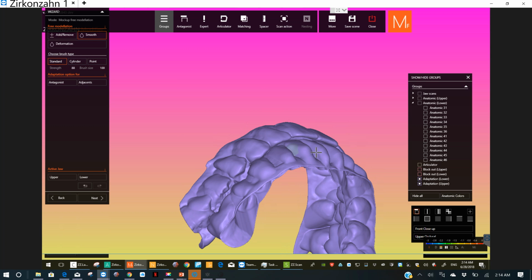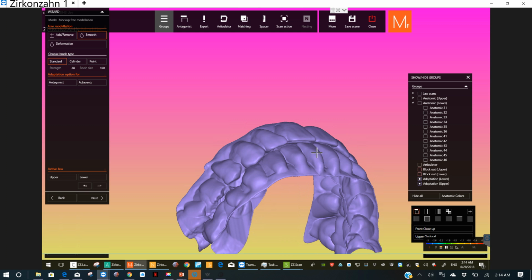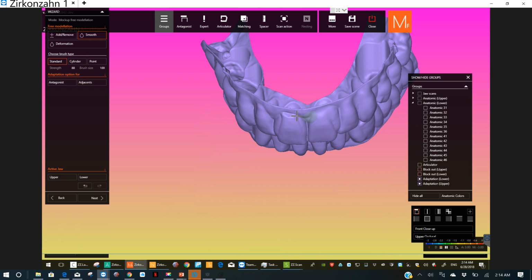We want this to be paper thin so it doesn't feel bulky on the front, and we'll need that little bit for strength. And if it annoys their lip a little bit in the few days before the surgery, good. They'll be less annoyed by their bridge. We're trying to break them in a little.